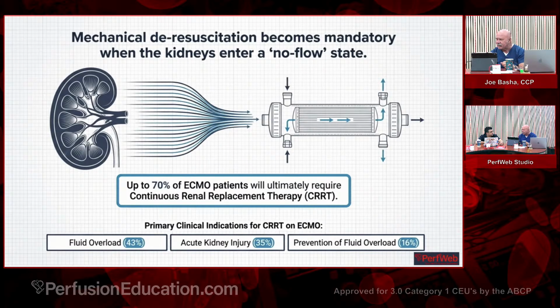Plus, when you're doing CVVH and replacing it with a fluid that you want the plasma water to look like, without pumps, you're also having a hard time doing that. So you can do it, but it's very hard. Plus, you don't have any of the safety mechanisms that come along with the CRRT machines. Exactly. They have their own built-in safety mechanisms because you're going to go right back into the ECMO.